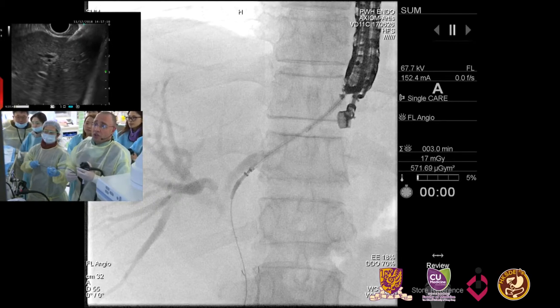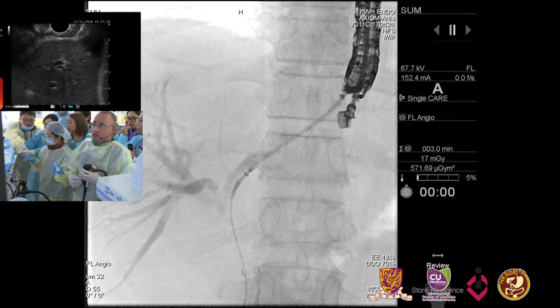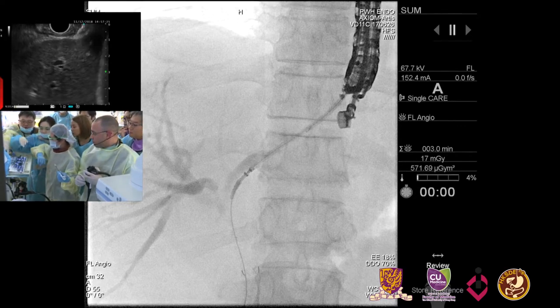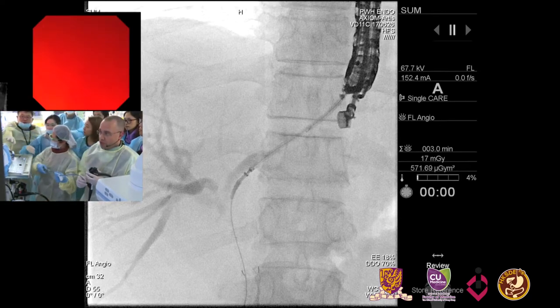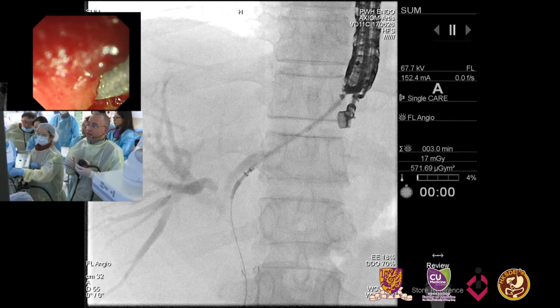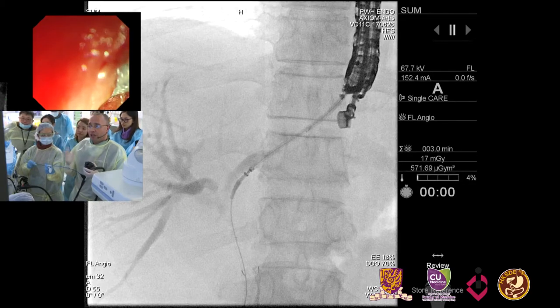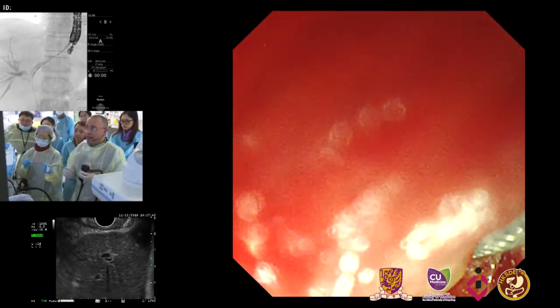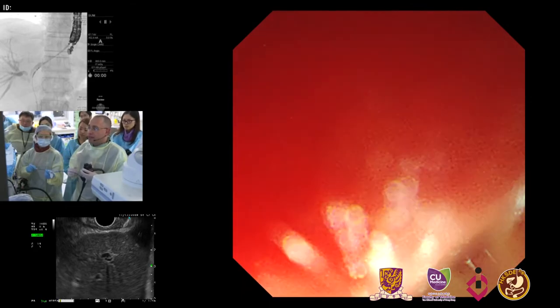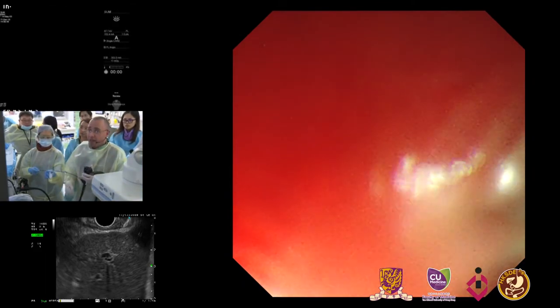Okay. Can I have my endoscopic image, please? Endoscopy. Okay, good. Here we go. Very important here: this is a long stent, a 10 centimeter stent, so not an issue. But generally, we need about 3 centimeters of stent in the stomach side. With respiration, the liver and the stomach move away from each other, and there are some deaths that have been reported from intraperitoneal migration of these stents. The uncovered part will help anchor it within the intrahepatics, but also leaving adequate stent length in the stomach avoids this issue. So let's start deploying here, please.